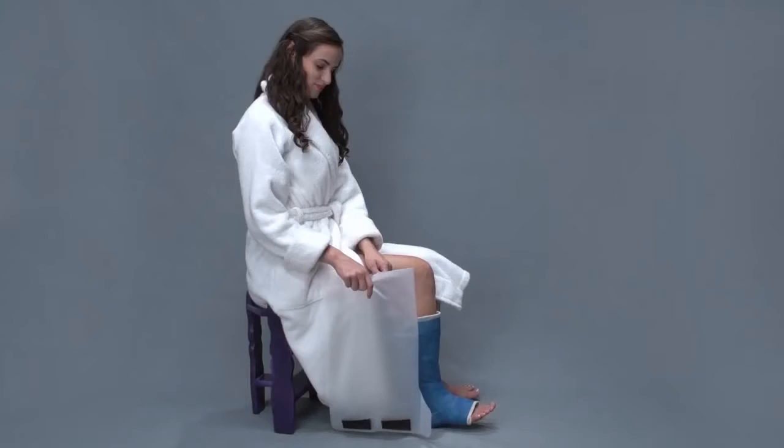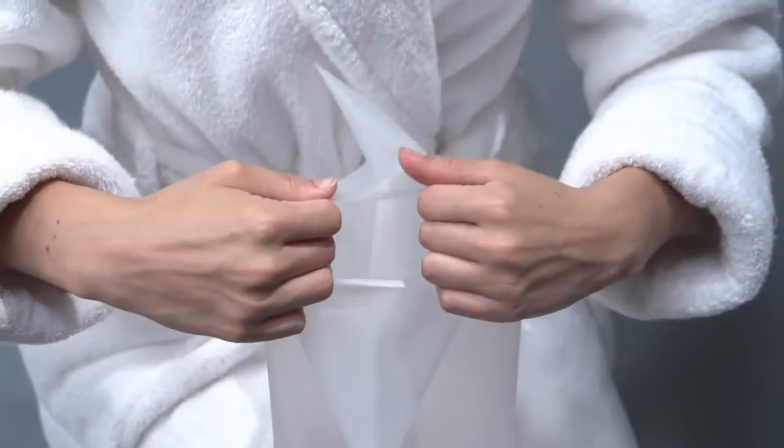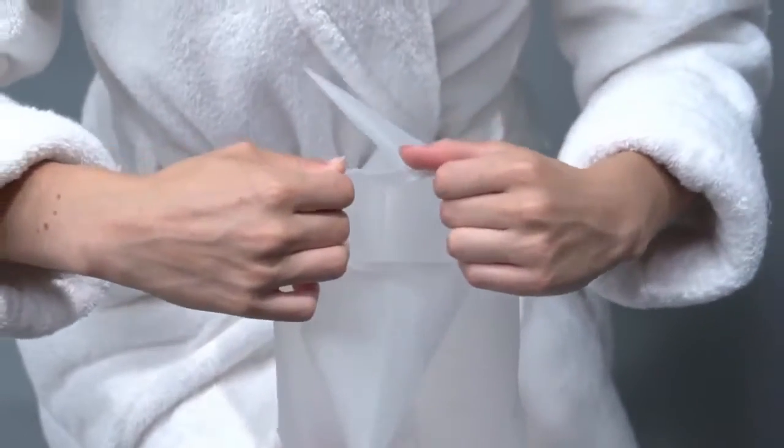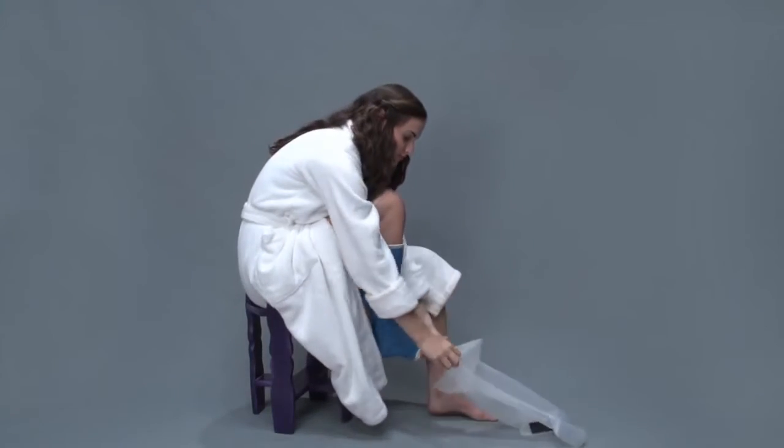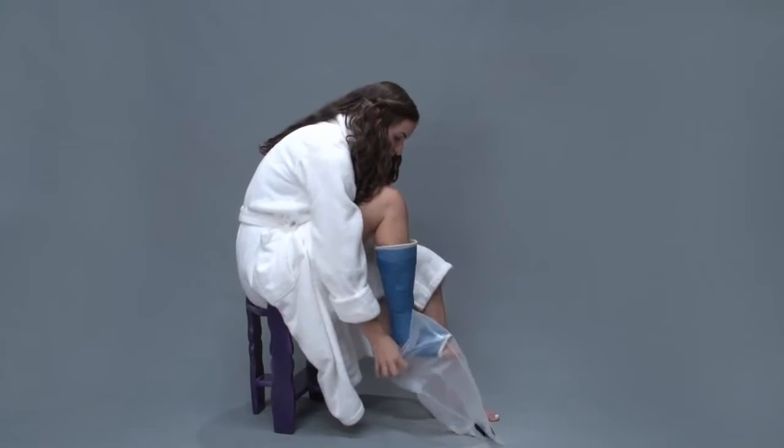To use your AquaShield watertight cast and bandage protector for showering, first stretch the opening to enable sliding it over your foot. Then pull it up by the corners as high as it'll go onto your leg.